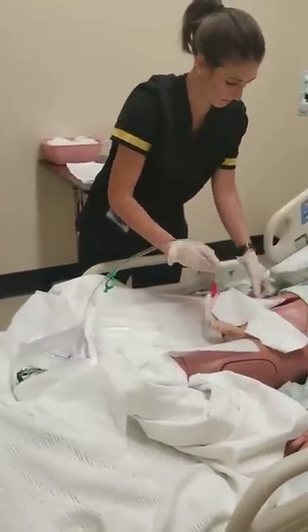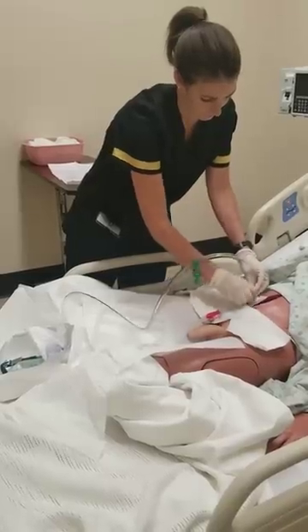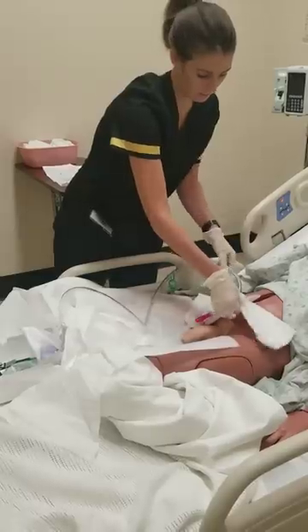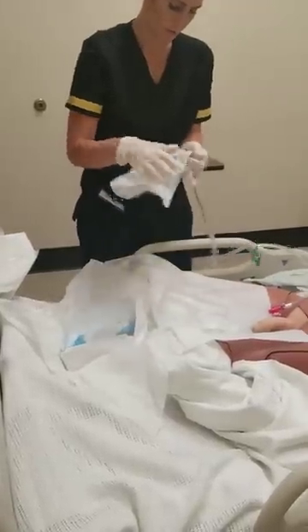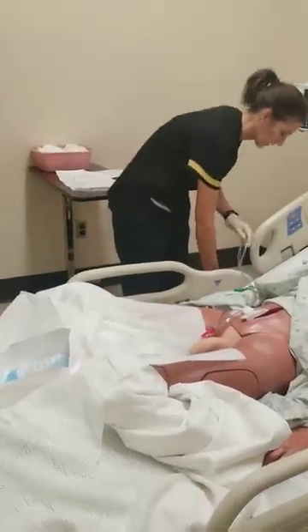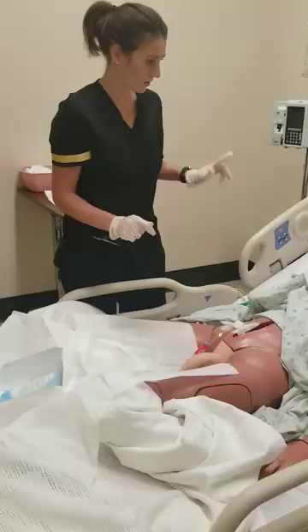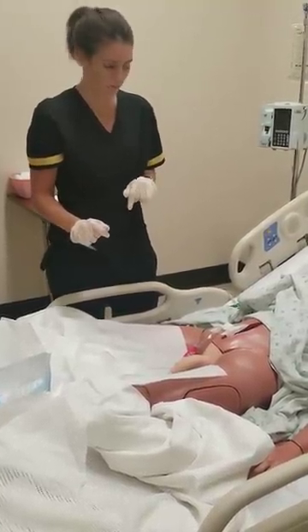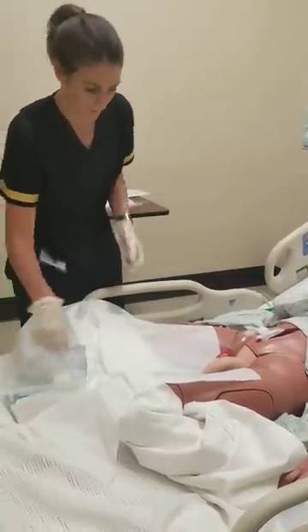Go ahead and tape it to your abdomen. Take this up from here. Form a dependent loop and hook this down here, not on the side. I can draw urine straight from the bag, or I can use the port. Anytime after 24 hours, I need to use the port. You can roll this up.